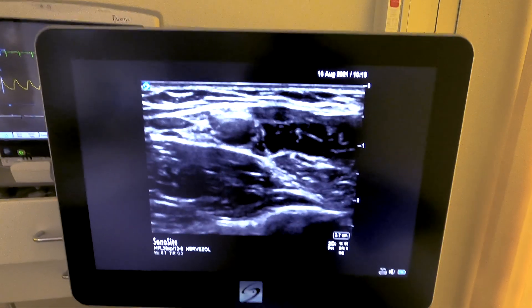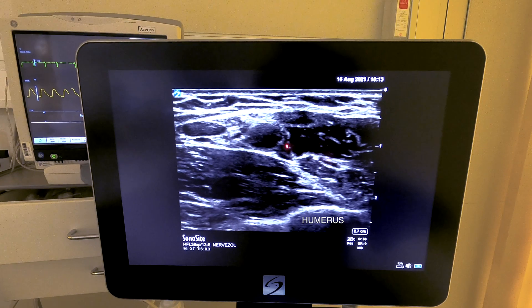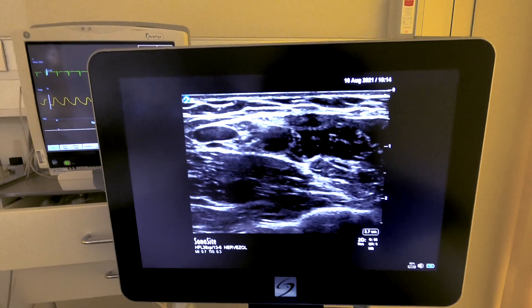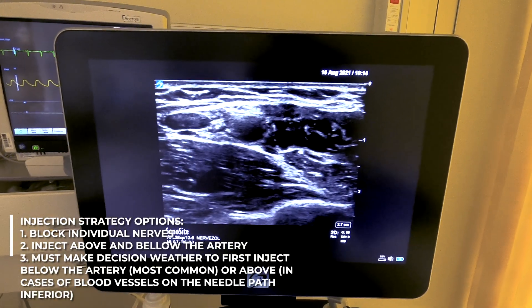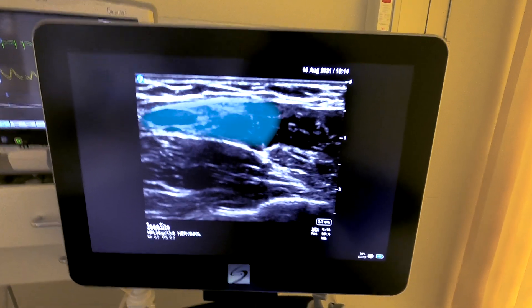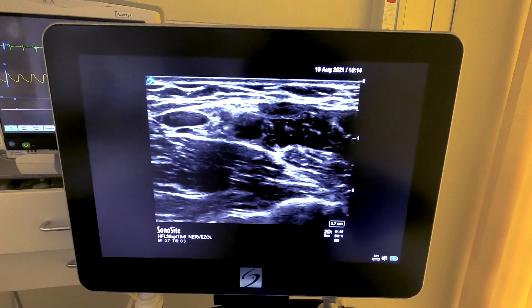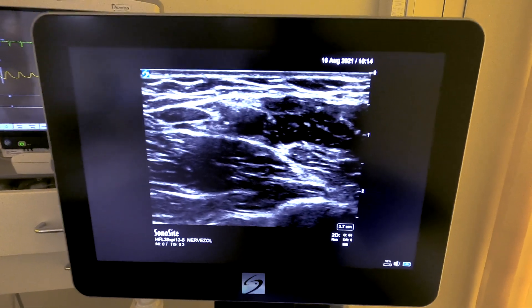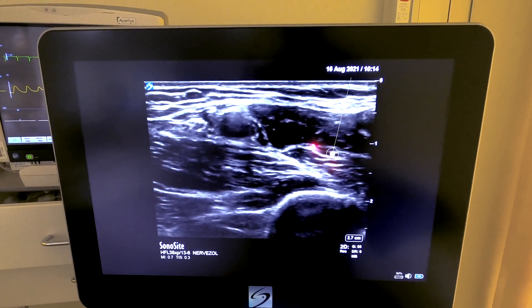We have several different options. The first option would be to pass a needle to block the median nerve, then the ulnar nerve, and then advance to get the radial nerve. Ideally, with each axillary block we would like to fill this space with local anesthetic and not worry about blocking separate nerves, but in this particular situation that may or may not be possible. Let's also find where the musculocutaneous nerve is — and there it is.